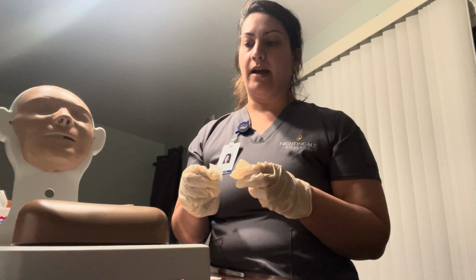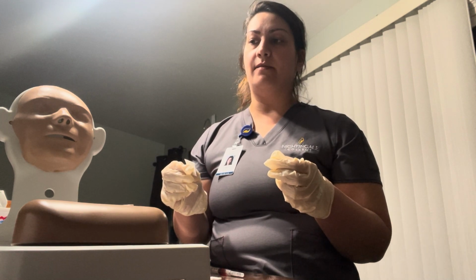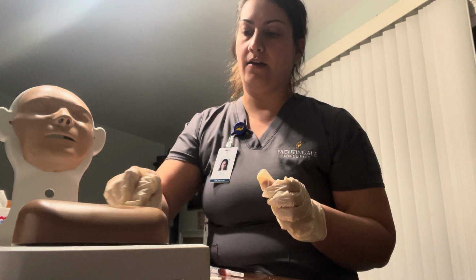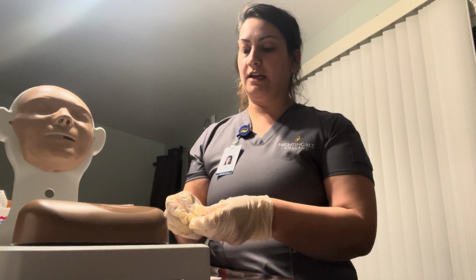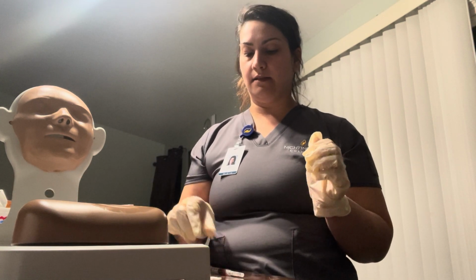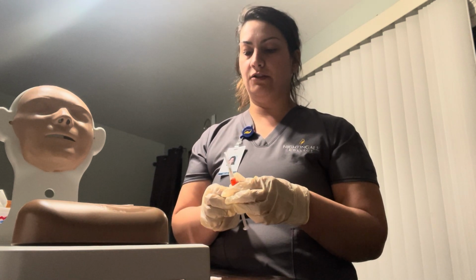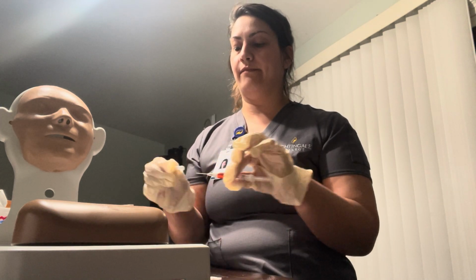And we will start at the center and go out 5 centimeters, 2 inches out. I'm going to let that air dry. I'm not going to touch it. Discard that. Next, once my area is dry, I'm going to grab my syringe and I will take off the cap.